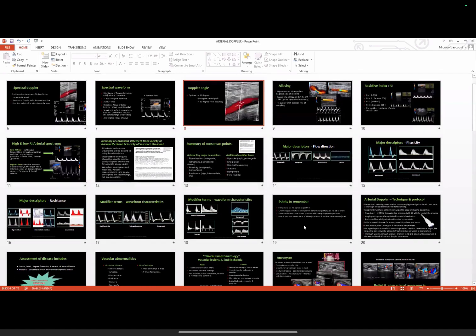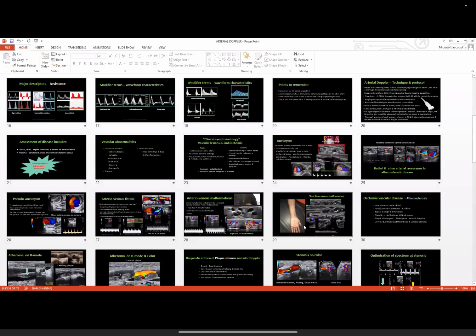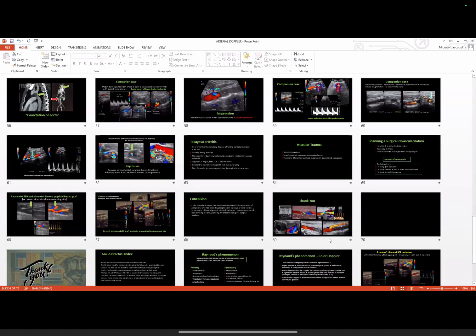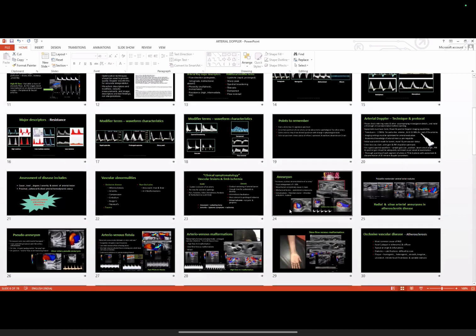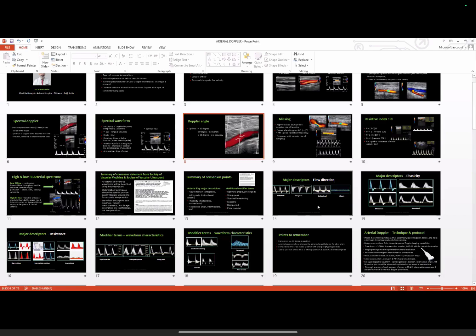Right? Yes, thank you. Now, is there a chart or any values for lower limb peak systolic velocities? These are available in literature. Normal velocities are always variable depending upon the cardiac status. Normally, values are available in the femoral artery, around 100 to 180. There is definitely a range. So there is a normal range of peripheral arterial blood flow peak velocities in the upper limb as well as the lower limb. But these velocities depend on cardiac status and cardiac rhythm.